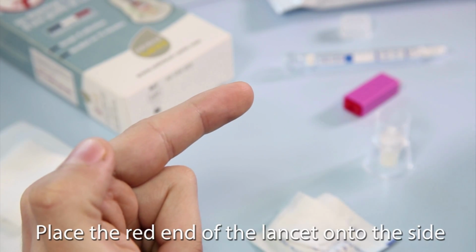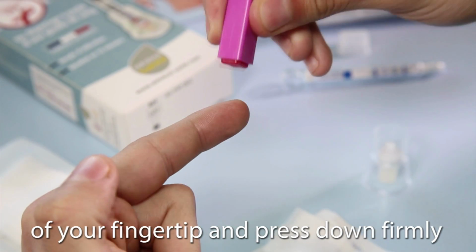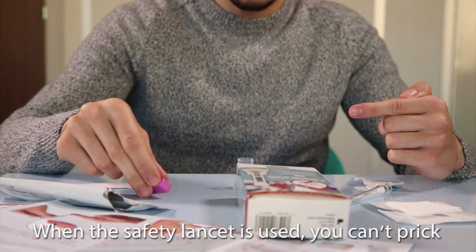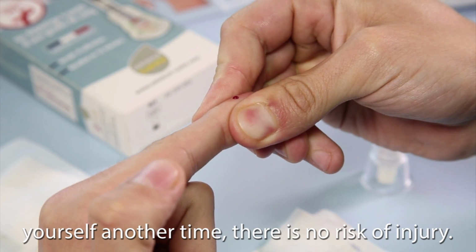Place the red end of the lancet onto the side of your fingertip and press down firmly to prick your skin with the needle. When the safety lancet is used, you can't prick yourself another time. There is no risk of injury.